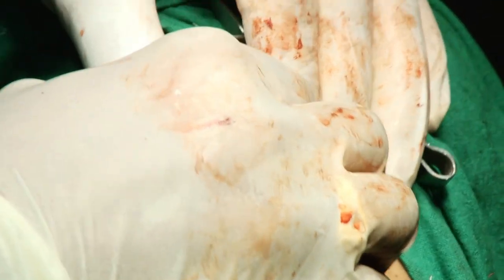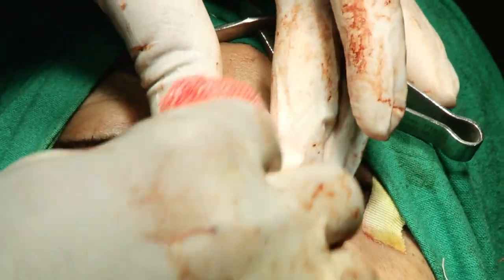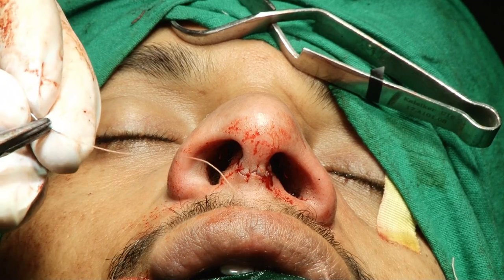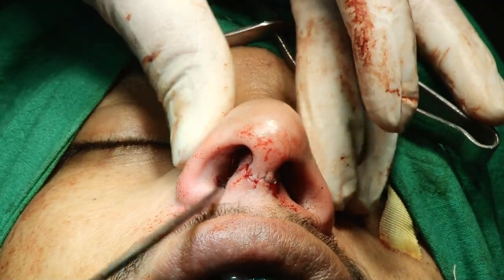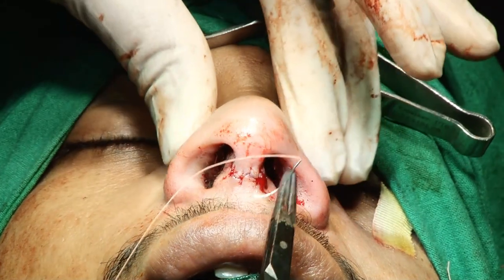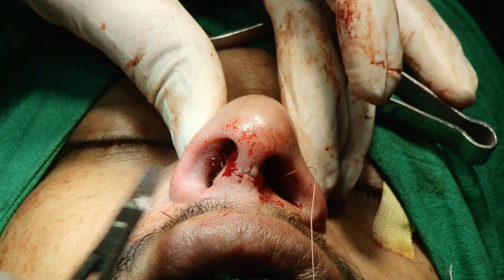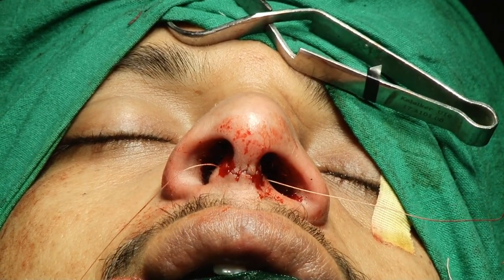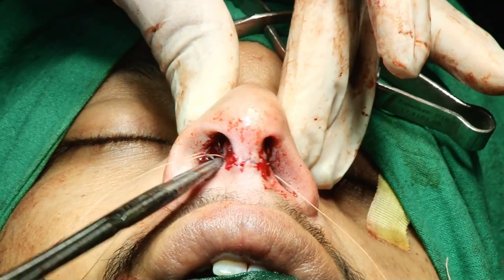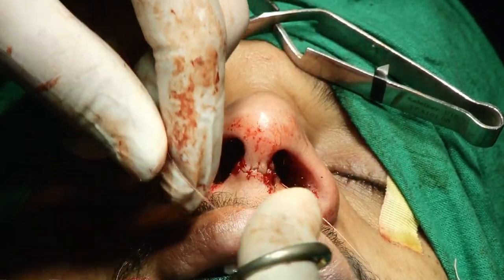Now we have this one. Give me the 4-0 Vicryl. So we put the 4-0 Vicryl because we just put one suture, because earlier the septum was in here. Now we correct the septum, but this is the skin. So we just put one suture here. Now the feel is starting.